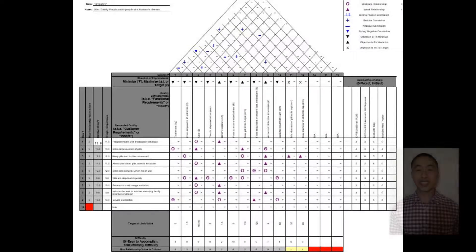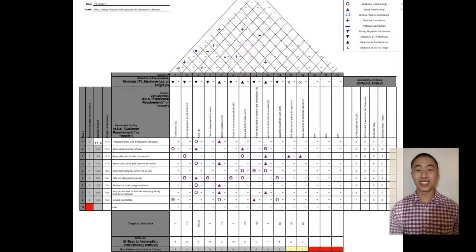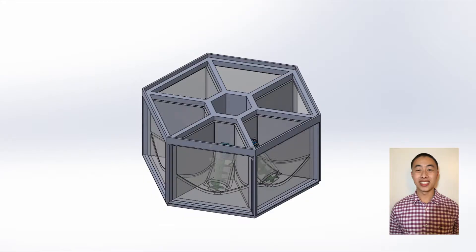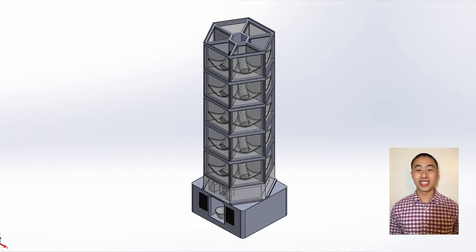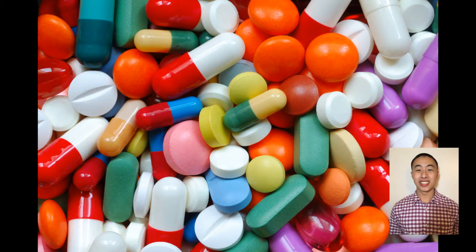QFD was performed to compare our design to competitive products and to generate functional requirements. We found that no product currently on the market is able to meet all the requirements we have set. The largest improvement with our design is the increased pill capacity and the high level of programmability. Our design can hold up to 2,100 pills per module and up to 5 modules at a time for a maximum capacity of 10,500 pills. This is much higher than current products.